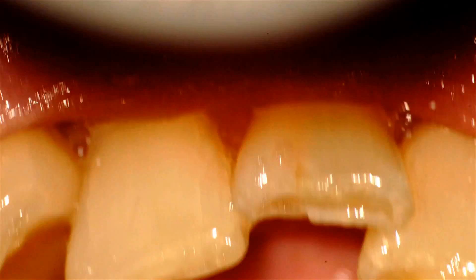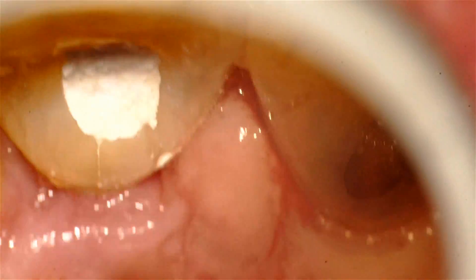Biodentine is an ideal material to place in a communicating periodontal sulcus because when it sets, it will help maintain stability of the periodontal tissues, and you rarely get a deep pocket.